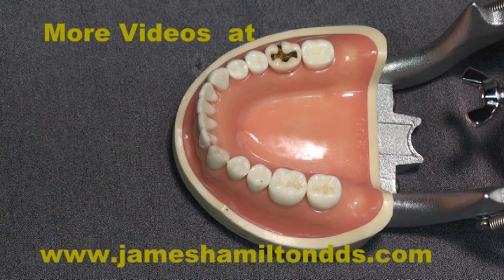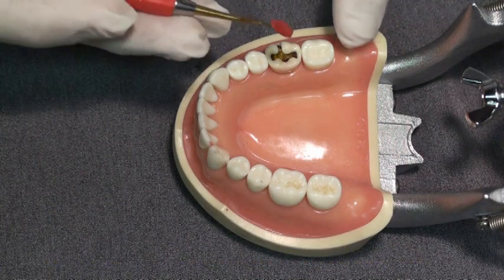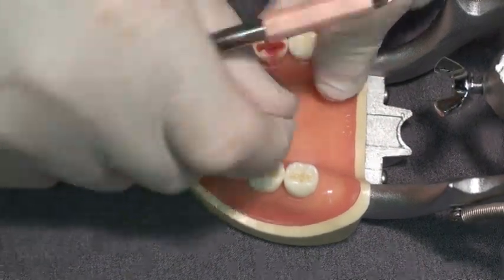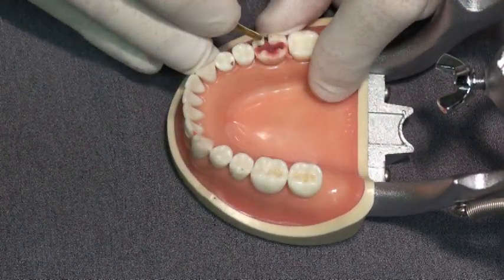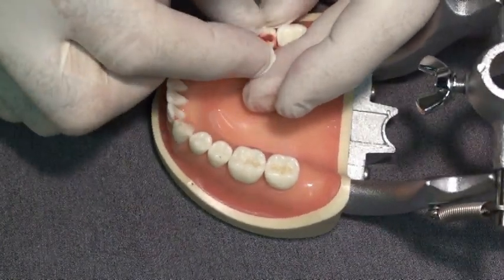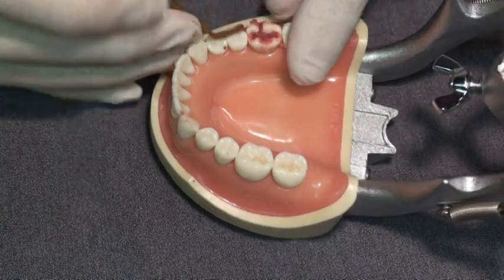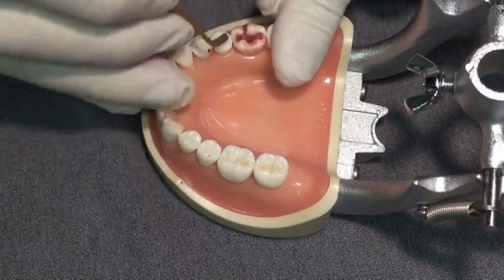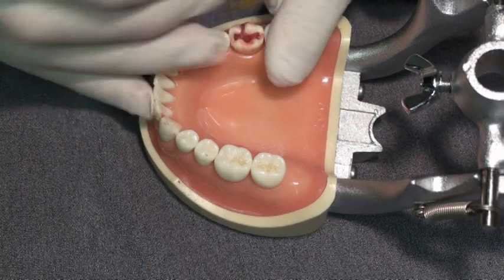This is a time-saving technique where you can restore a gross carious lesion very quickly, saving 5 to 10 minutes of chair time on every composite that you place. After anesthetizing the patient, we're going to take some red border molding wax and place that into the tooth, then force it into the tooth with our gloved finger. This creates a very smooth surface. We have to place some wax into the buccal as well, again done with the gloved finger. Then I take an instrument and scrape away the excess. This is all being done while the patient is gaining anesthesia.